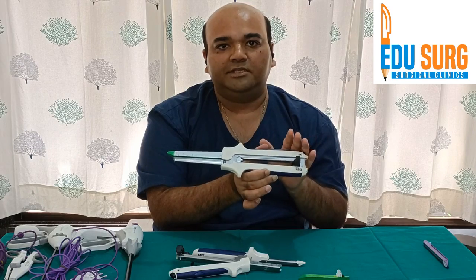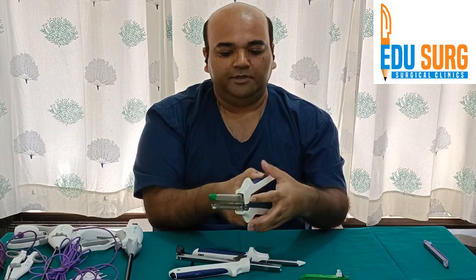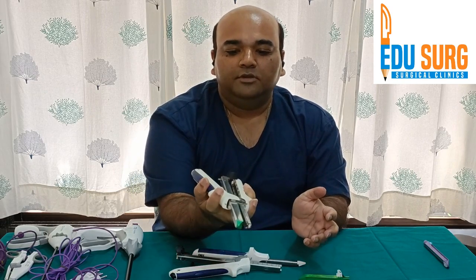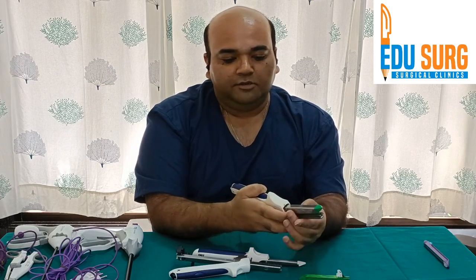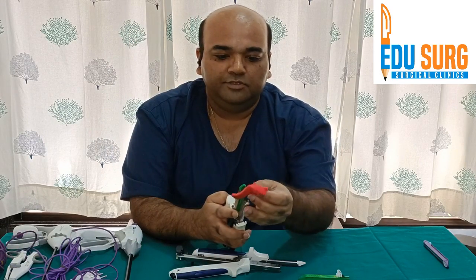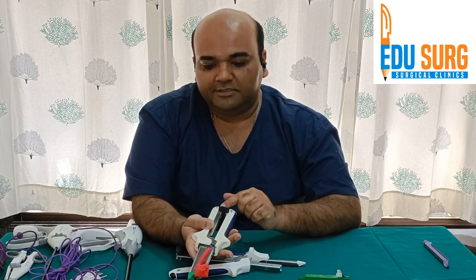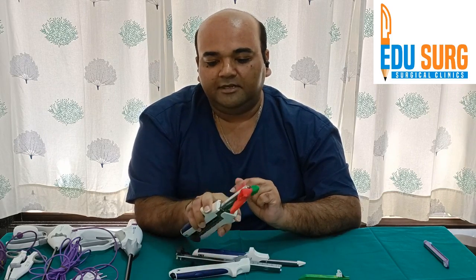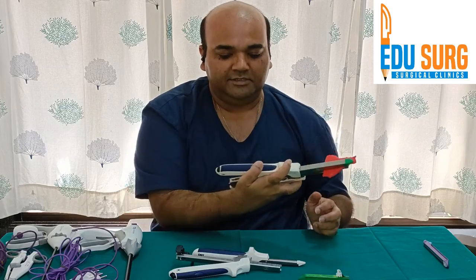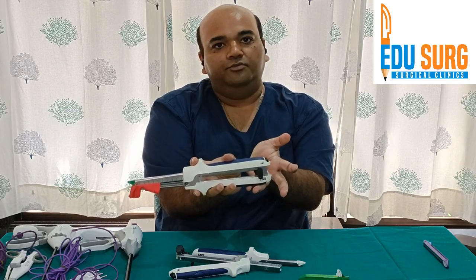This is how you load a stapler. When you want to open it, the classical teaching is to use two fingers to grasp the stapler. You open it slightly, then slide the tissue in and lock the stapler. This is the standard grip of the stapler. The 100 mm is difficult to open single-handed, but the black button helps in opening the stapler.